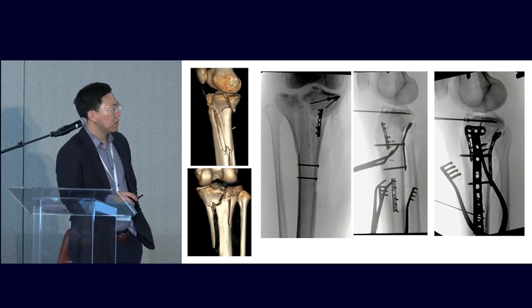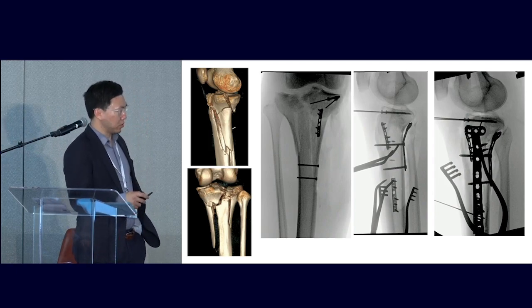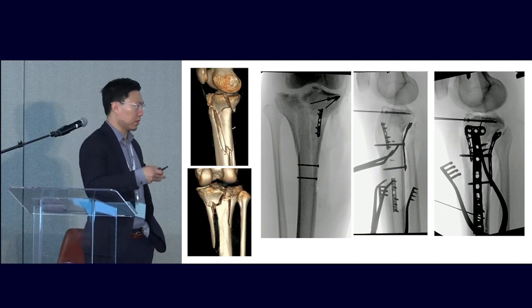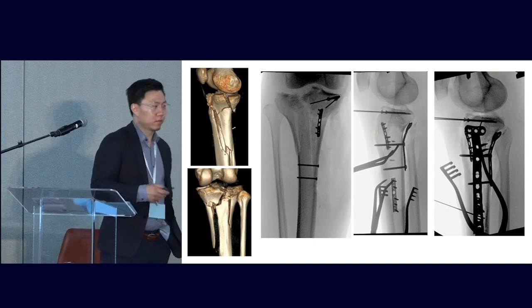That one, I think that might have been a suture anchor. I think there's a little bit of an injury to part of the MCL, so I wanted to tack that down. Oh, you had a couple of them up here. Yeah, a couple for the MCL. All right, so do you have any criticisms about the medial approach?